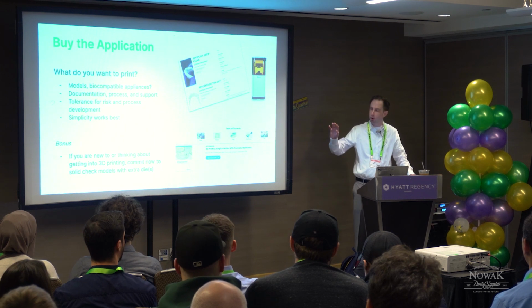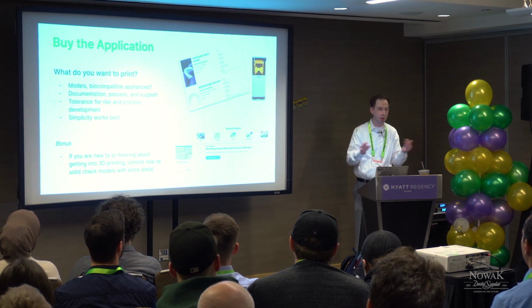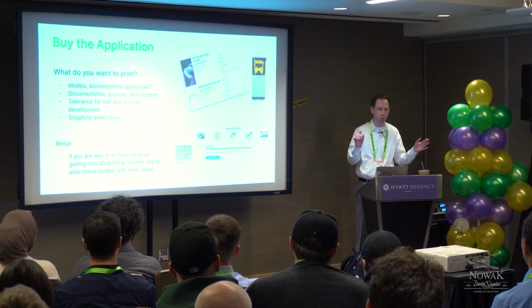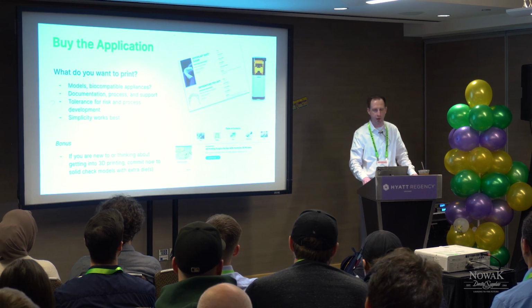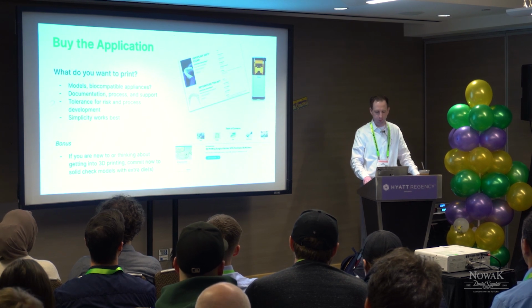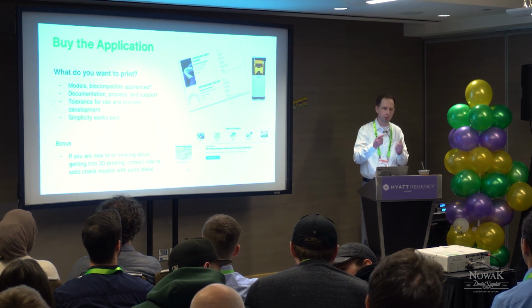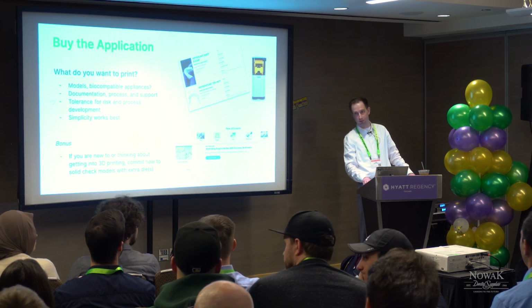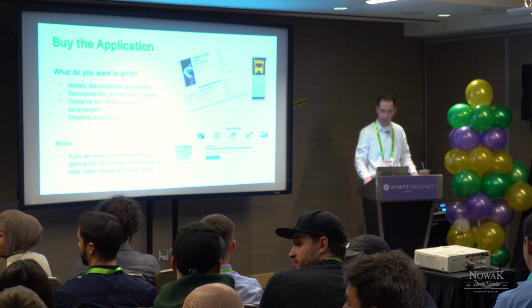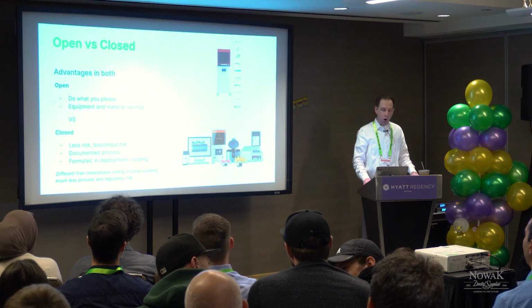But a bonus material here is if you're thinking about getting into 3D printing and you want removable dies, it's not possible. Okay, solid check models, extra dies. Just putting that out there. Everybody always has these expectations of removable dies. It is not consistent. Nothing that I'm happy with. Depends on your level, just what you accept. I don't want to adjust dies. So solid models, please. Anybody doing removable dies? Do they work? Yeah, removable. No, it's great. We have the solid and the extra dies. That's it. Ding, ding, ding.